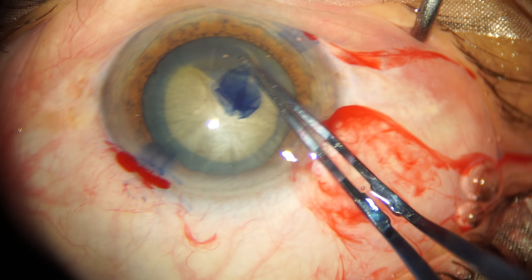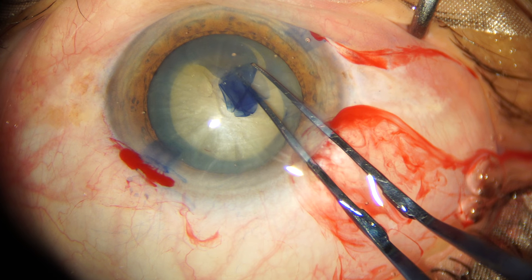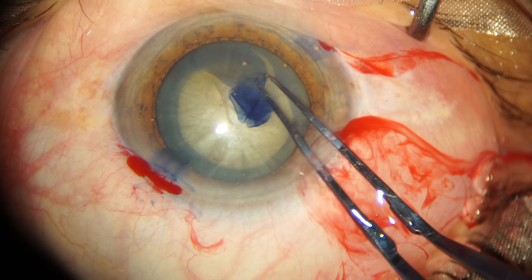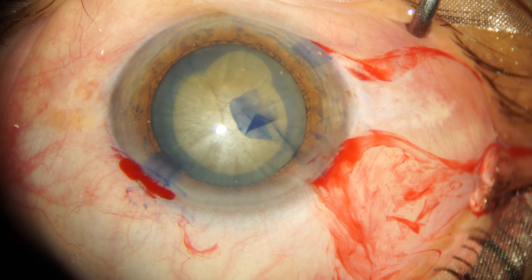The trick of bringing it back into a continuous curvilinear capsular rhexis is to grasp the flap that has run off and to apply force in the opposite direction. Let's see that again.